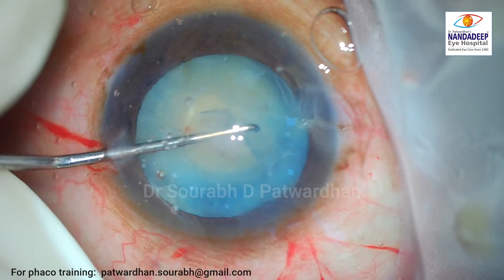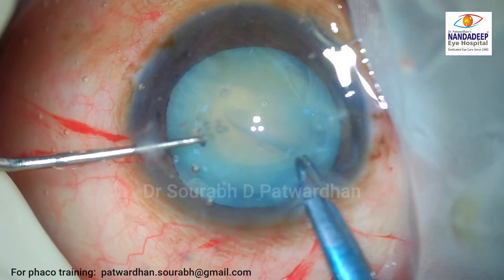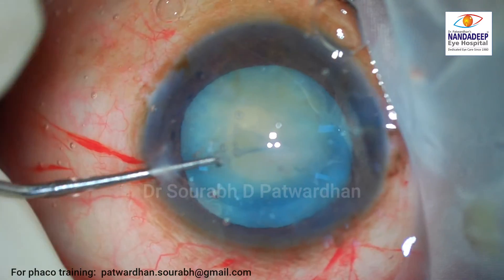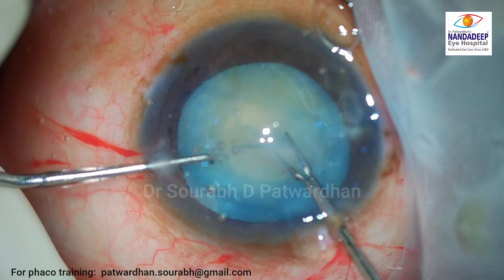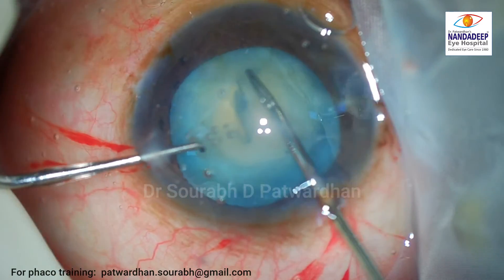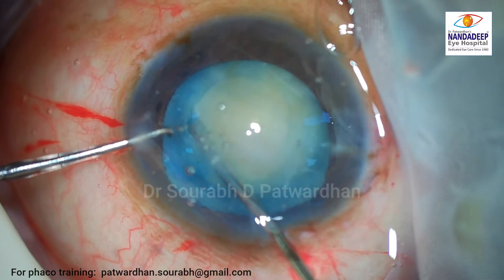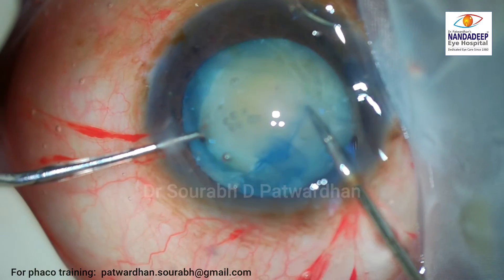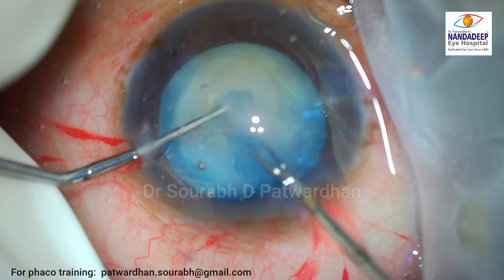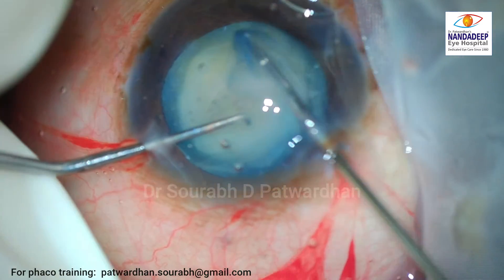Once I nudge it around to check exactly what it is, I decide to create a nick using Vannas scissors and then proceed with the capsulorhexis. You can use micro-scissors for this as well. As you can see now, the capsulorhexis becomes easy because there are no more fibrosed areas in the capsule, and we can complete the rhexis very easily. Since it's a non-intumescent cataract, it doesn't tend to extend.